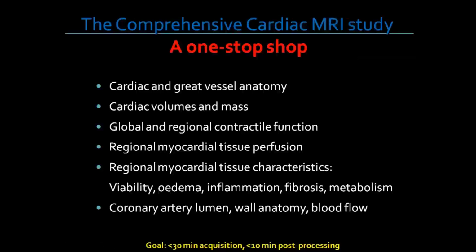And finally, the fourth reason why CMR is effective. It's a one-stop shop. You can look at anatomy, volumes and mass, contractility, tissue perfusion, viability, edema, inflammation, fibrosis, metabolism, and moreover, you can look at the coronaries.